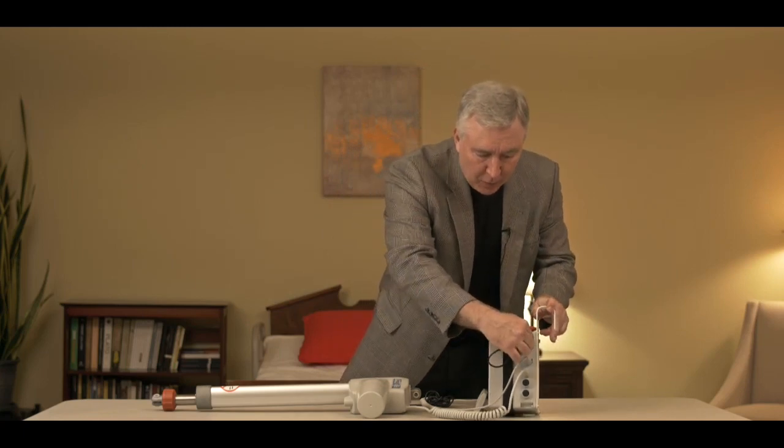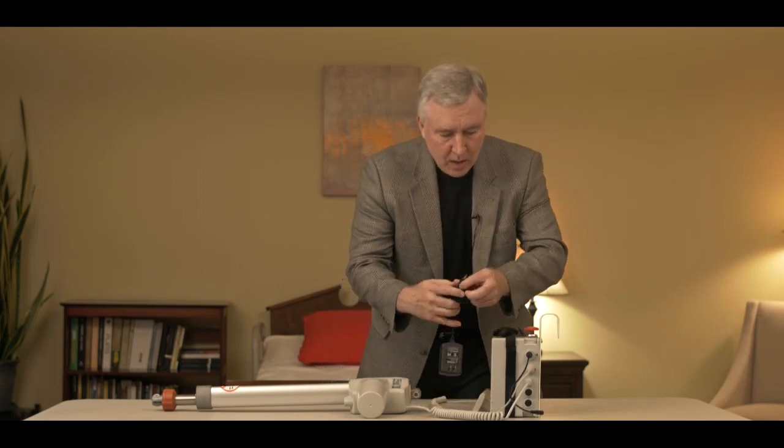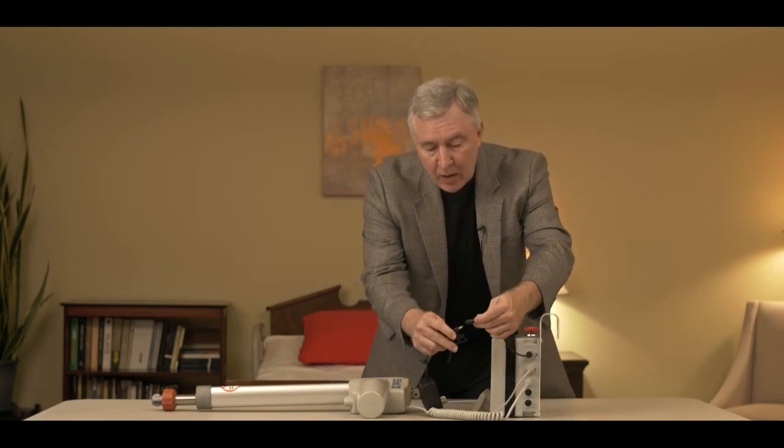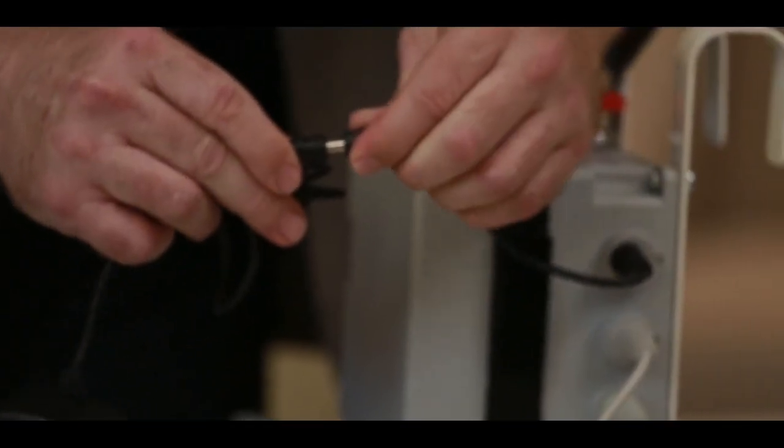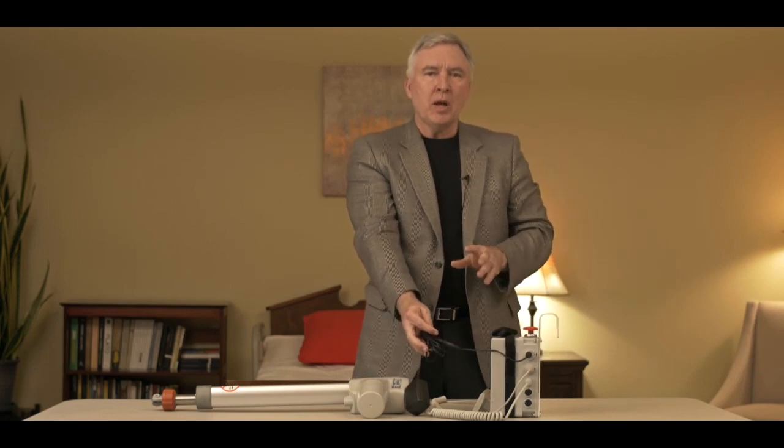Style 1 electronics typically has an adapter that plugs in first, a charger that plugs into the wall, and then an end that plugs into the adapter to charge up the battery. This particular style of system requires you to plug it in whenever you're not using it — that's the best advice I can give you to keep the battery charged: keep it plugged in whenever you're not using it.